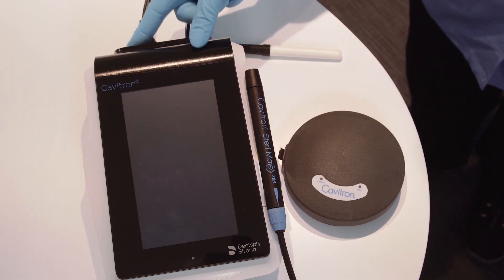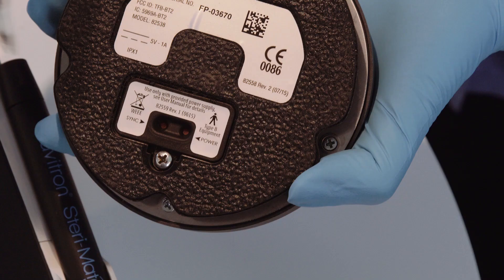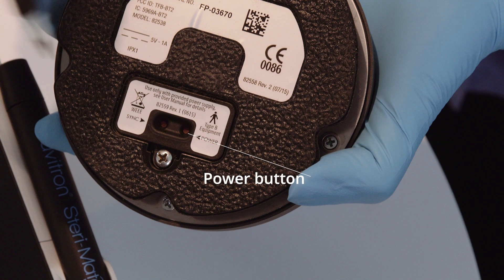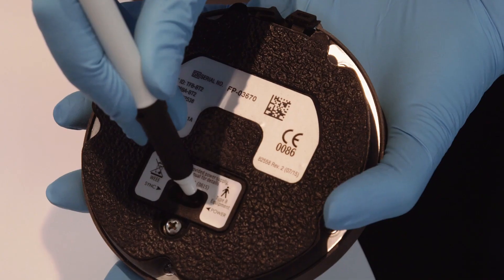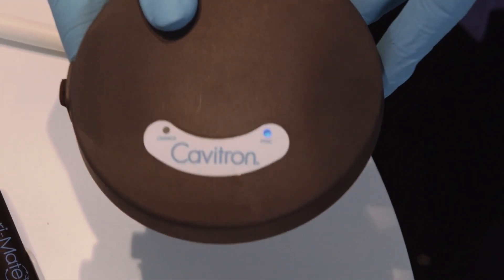To synchronize your foot pedal, begin by turning on the main power switch located at the rear of the system to the on position. The main screen will appear. This is also referred to as the scaling menu screen. Next, turn on the foot pedal by pressing the power button on the bottom of the foot pedal and hold for at least three seconds. A light on the top of the foot pedal will illuminate to verify power.